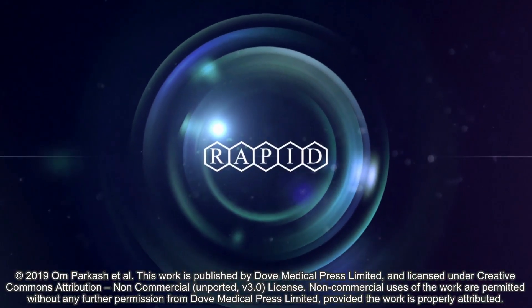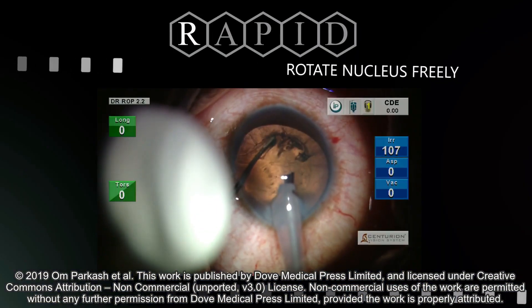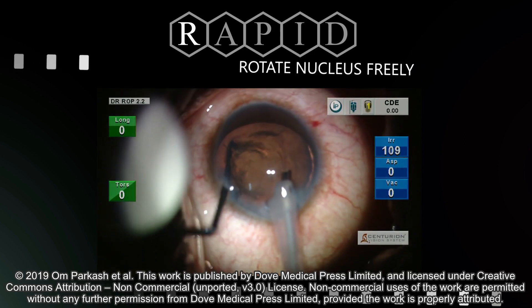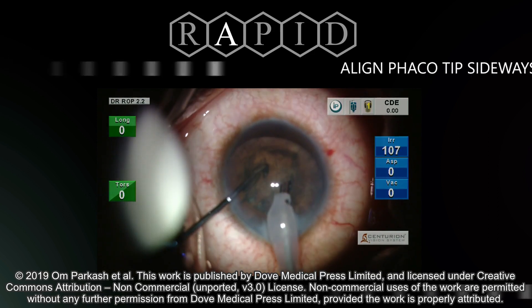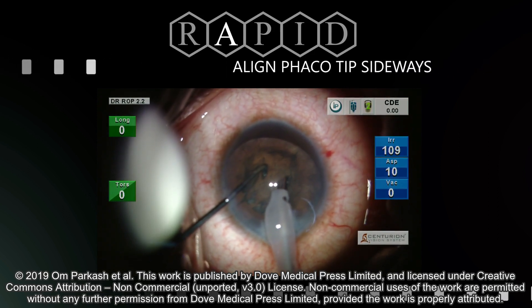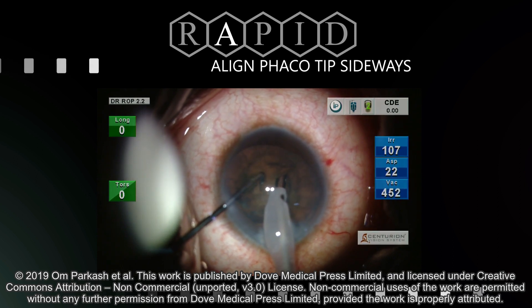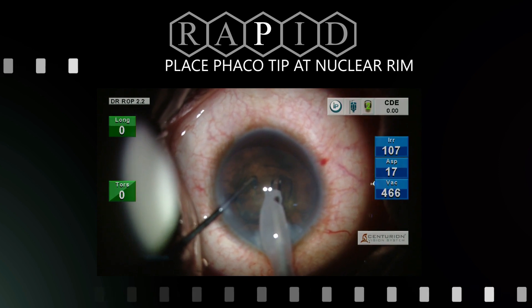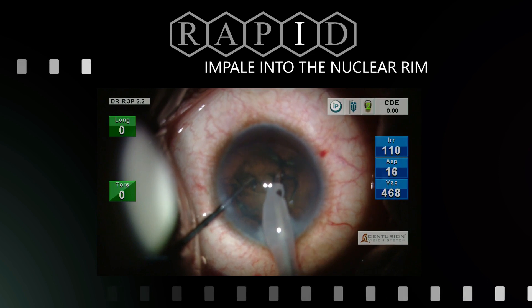We describe a technique based on the acronym RAPID for soft cataracts. The nucleus is rotated freely in the capsular bag from the side port incision by a chopper. The tip is partly aligned sideways towards the direction of the side port. Placement of the tip is done at the nuclear rim, and the tip is then impaled into the nuclear rim.